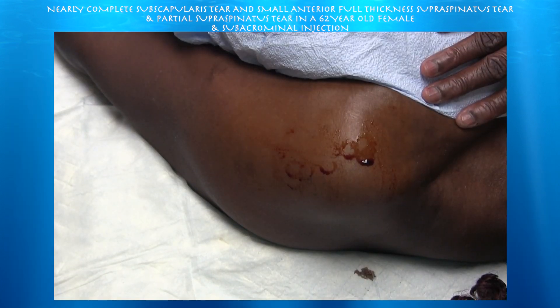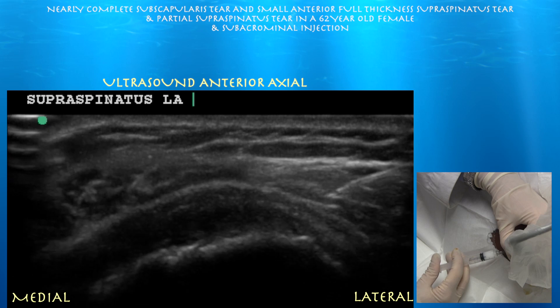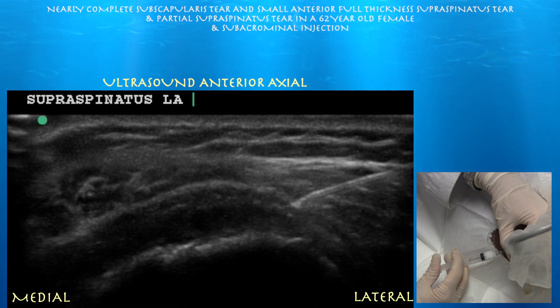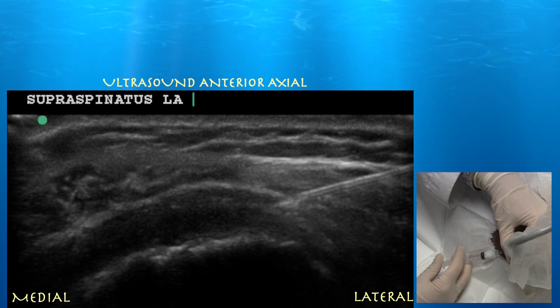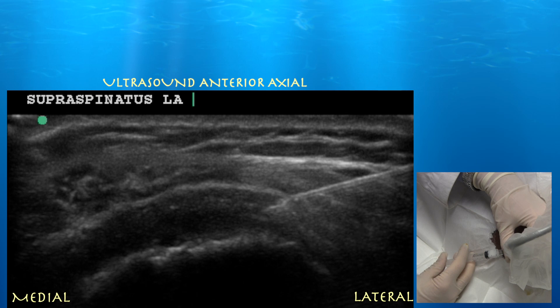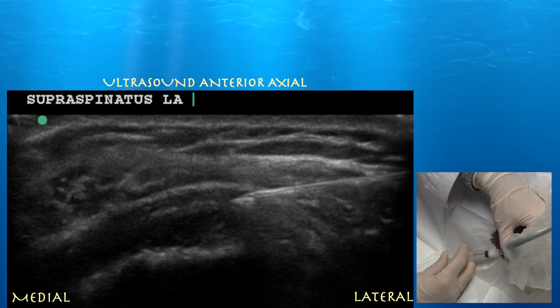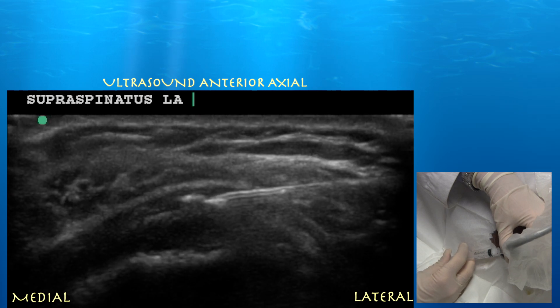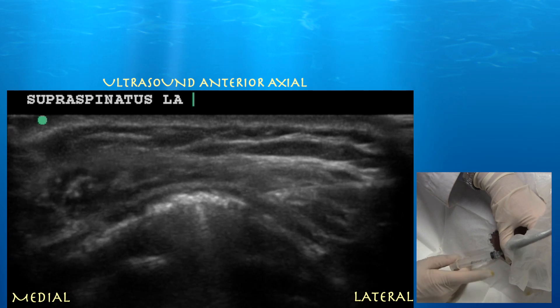We're going to go ahead and do a subacromial injection for pain relief. Here's our needle approaching the subdeltoid bursa, which is about a couple of millimeters away. Now we're approaching and entering the subdeltoid bursa. The first flash of injection may have been somewhat superficial, so we're threading the needle through the subdeltoid bursa, advancing it proximally. There may be some inflammatory tissue within the bursa making injection difficult. But the injection spread pretty nicely over the supraspinatus tendon, and she did well from the procedure.